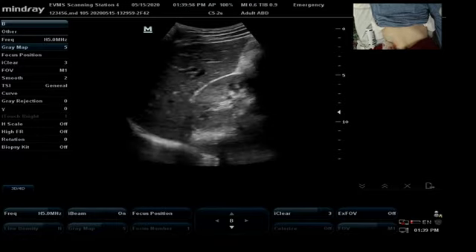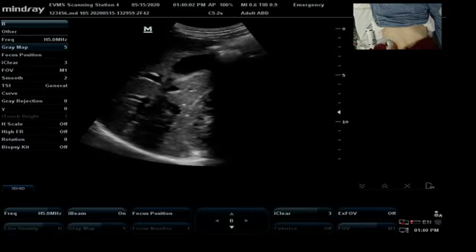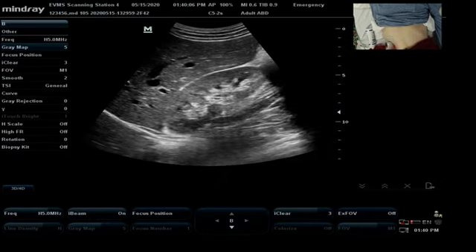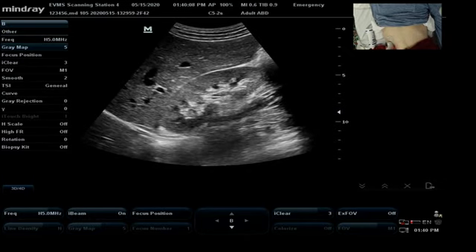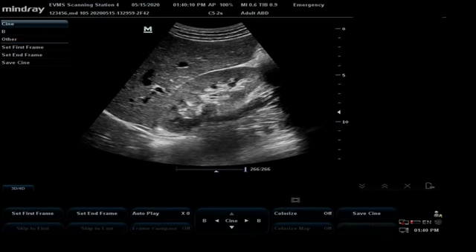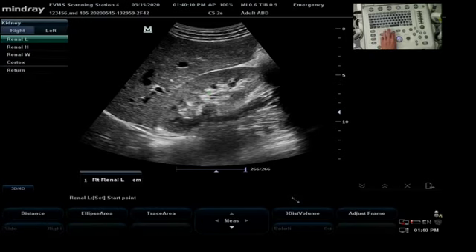So for today's lab, your image requirement is a long kidney. Big breath in. And you're going to measure two things on that kidney. Now, breathe. As I was scanning, I was paying attention to the bottom of the screen. I have almost 2 fingers between the bottom, so I like that. My focal zone's pretty much at the bottom of my kidney. So I'm going to hit measure.